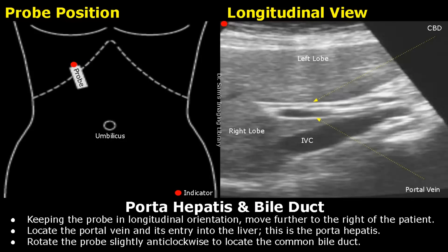While staying in longitudinal orientation, move further to the right of the patient, just below the right costal margin. You will start to see the porta hepatis around this area. It will be seen in the middle of the right costal margin, approximately. Locate the portal vein and its entry into the liver.